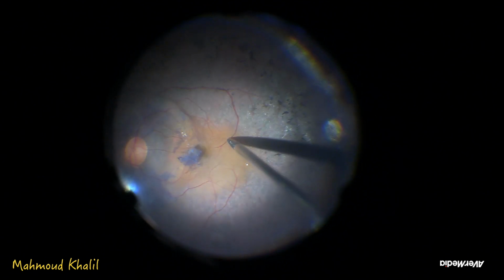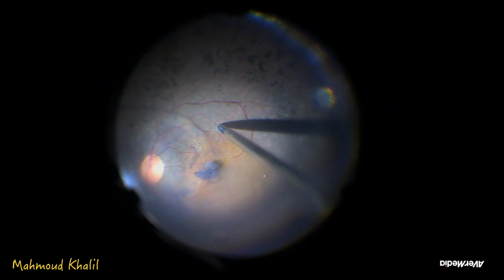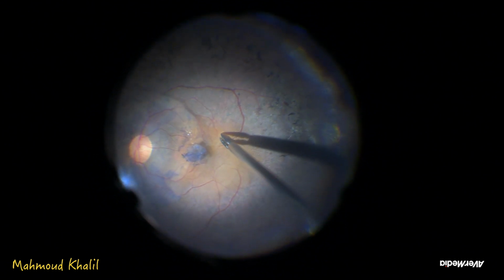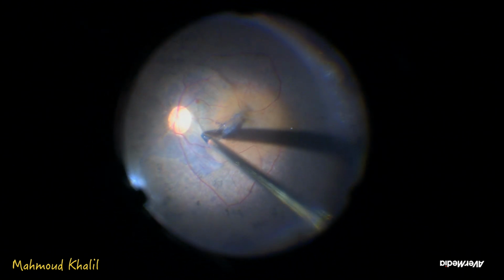As we see, there is a retinal fold present radially in the lower part of the retina. We don't have to make unfolding for this retinal fold. It will unfold by itself within a short period of time postoperatively, as long as we remove the traction over it.